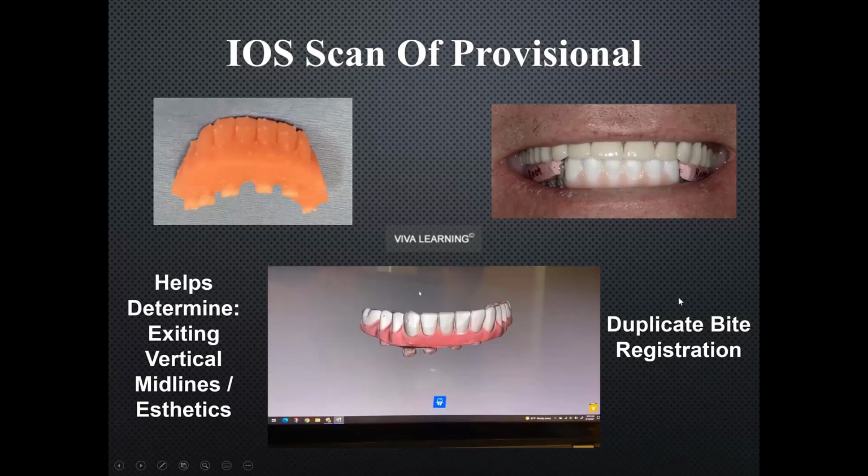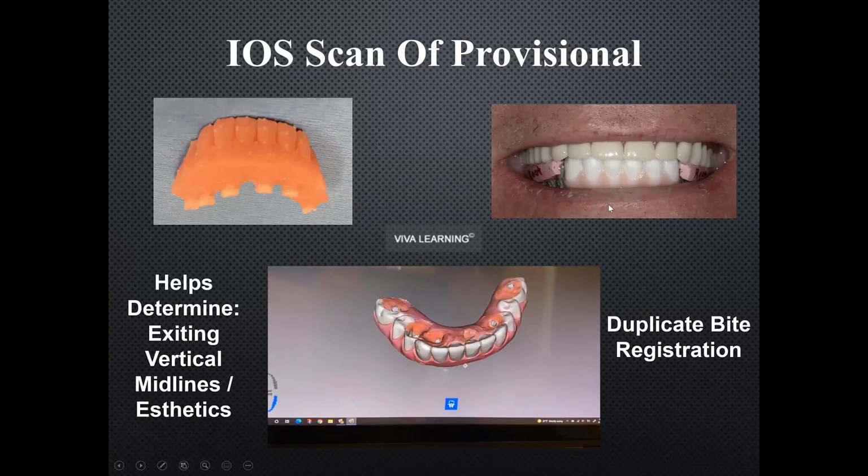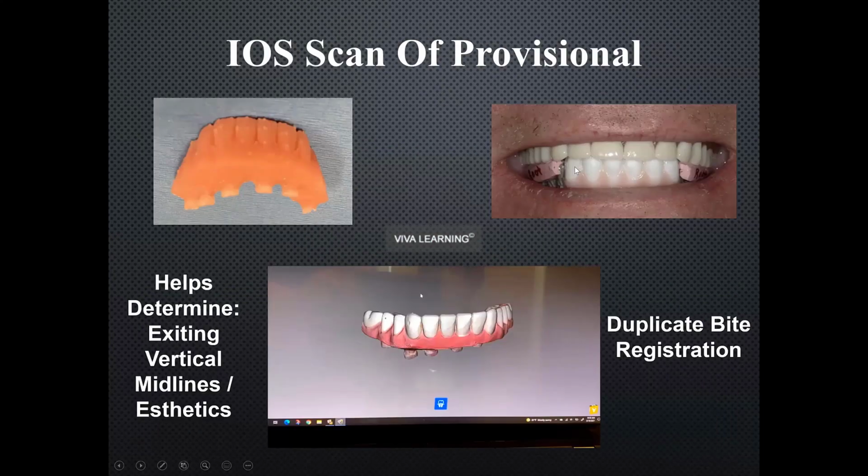So the first time I'm going to see the patient after this, he's going to come in and have teeth in the anterior where we've got it in wax, and you can see here the posterior is pretty much dead on. The bite looks really great with their bite seating jig. So it's very productive, a great use of chair time, and these kinds of steps transfer a lot of information.